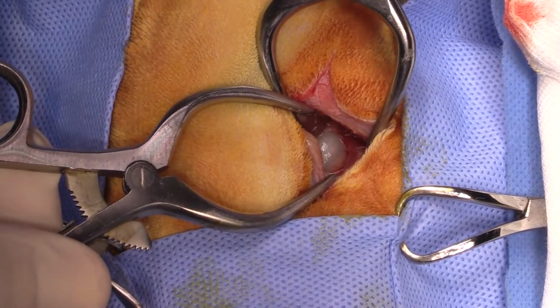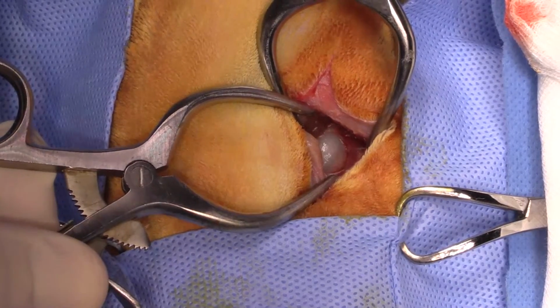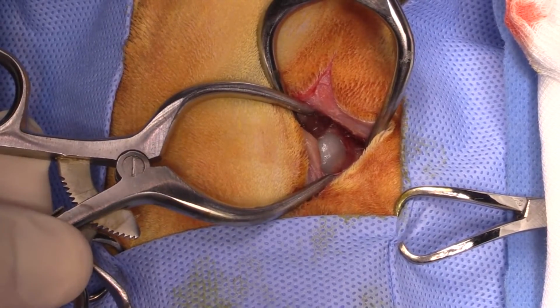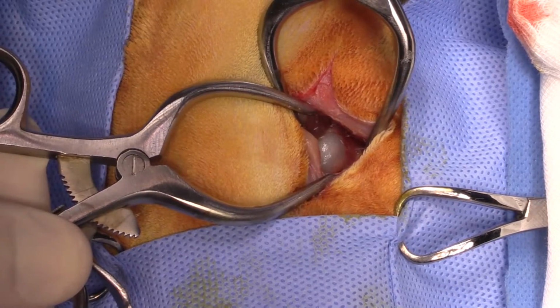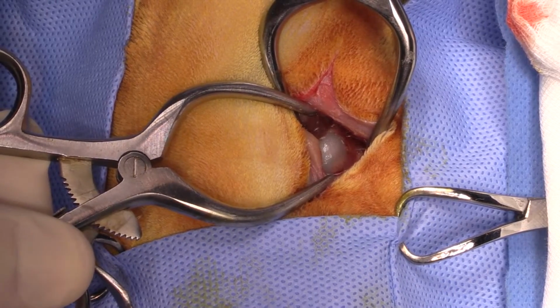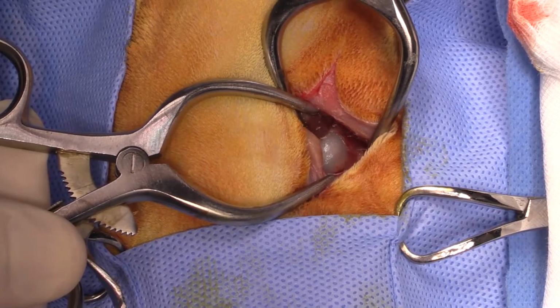You have to remember that in cats you have the ventromedial and the dorsolateral chambers, and you have to enter both of them, otherwise you'll get recurrence of the polyp. Now, some people try to just avulse the polyp from the oral cavity, but you have a very high recurrence rate when you do that. So we wouldn't recommend that as a primary treatment.